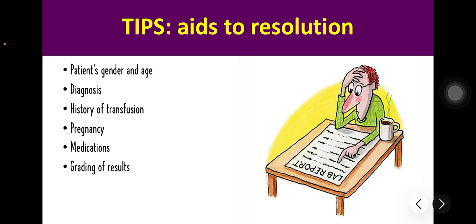So you also have stomach or pancreatic cancer. This can produce excess soluble blood group substances, or the BGSs, that neutralize the laboratory testing reagents, causing false negative forward typing. For history of transfusion, knowledge of recent transfusions is necessary to resolve mixed field reactions such as in group 4 ABO discrepancies.